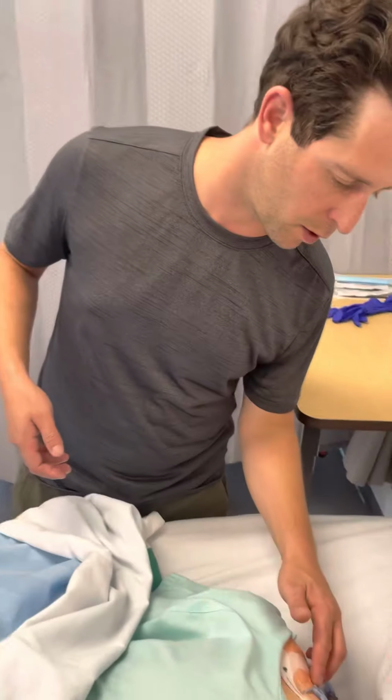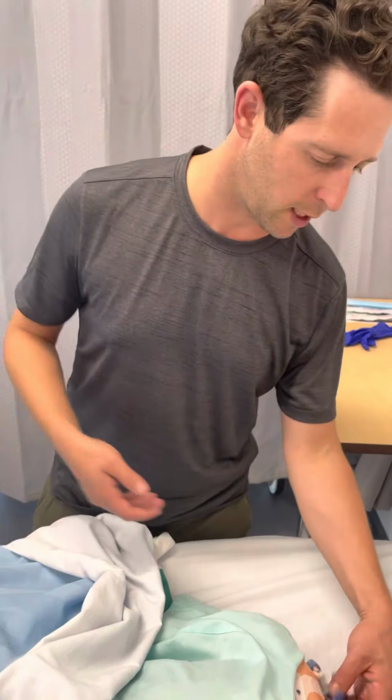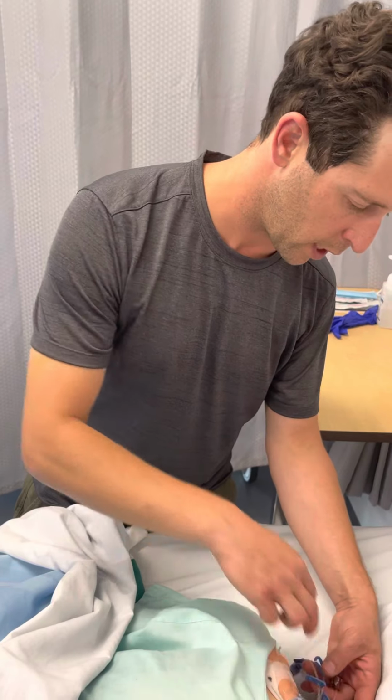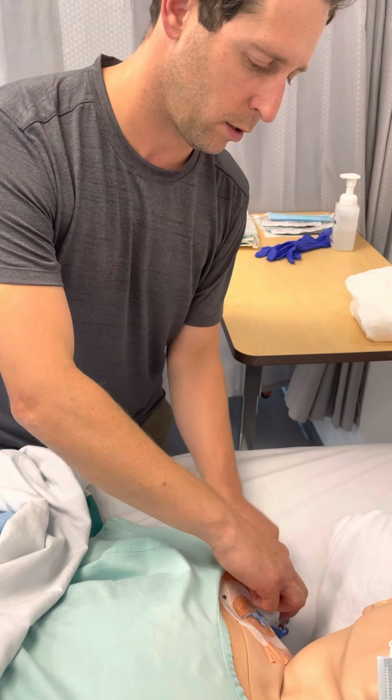It does sit into the big vessel above your heart. You're right about that. And you can get blood products and different medications. It's also sutured into place, which yours is, and it has these clamps on it, which it does on every lumen. Good. I'm just going to take this opportunity to make sure that these are secure.